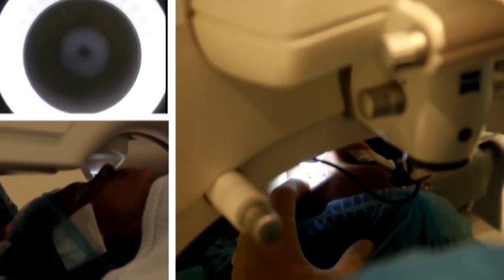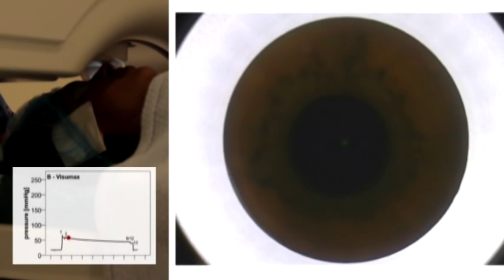The calibrated curved glass uniformly contacts the cornea when suction is started, raising the IOP to 70 to 80 millimeters of mercury, which is low enough to allow the patient to maintain vision.